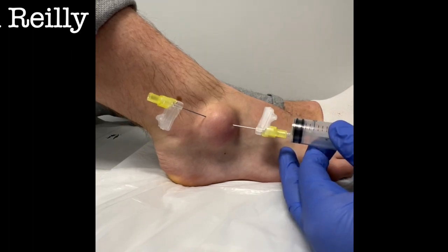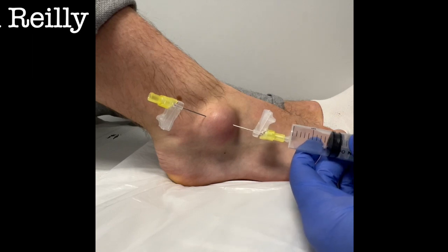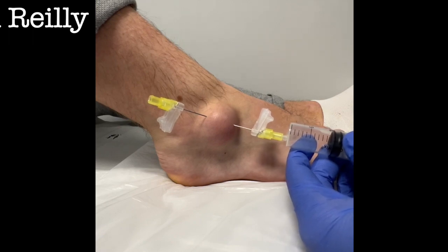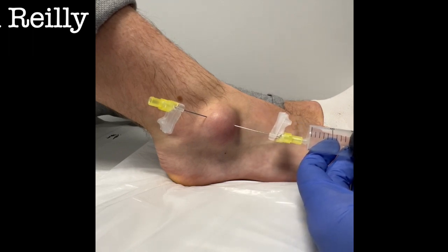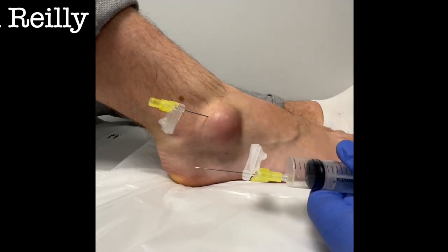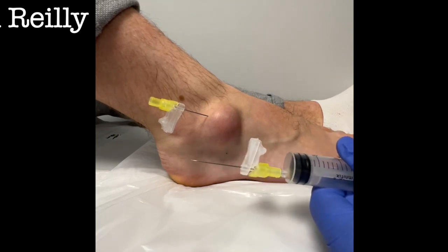Goopy is a technical term. Trying to do the aspiration is really useful for diagnostic purposes because sometimes you can't get any fluid off, and that tells you it's not fluid — it can be a lipoma. I'm not actually getting anything there at all, which happens from time to time. Interestingly, the seal on that needle has gone, so it's just blocked the needle.